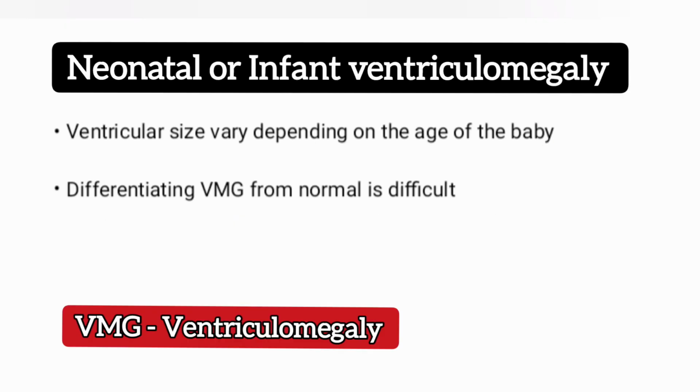Neonatal or infant ventriculomegaly. Ventricular size varies depending on the age of the baby. Differentiating ventriculomegaly from normal is difficult.